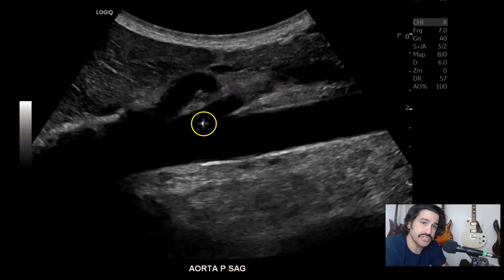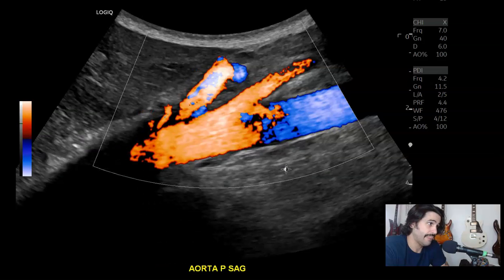I also like to take one image showing the SMA and celiac artery. SMA is here, celiac artery is here with color. This is with power Doppler with the map to show direction.